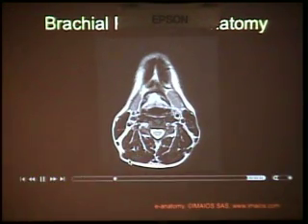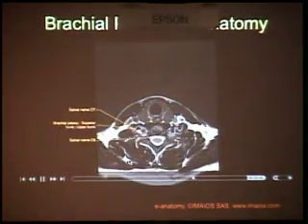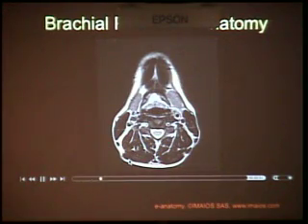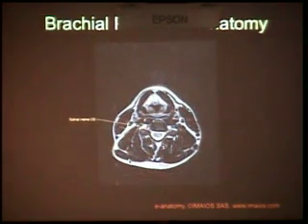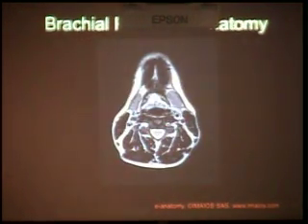And we'll quickly go through these axials. Same concept. Usually with brachial plexus imaging, you're going to have 3 planes. This is just following the nerves with an axial image, also T2 weighted. And then a coronal finally.